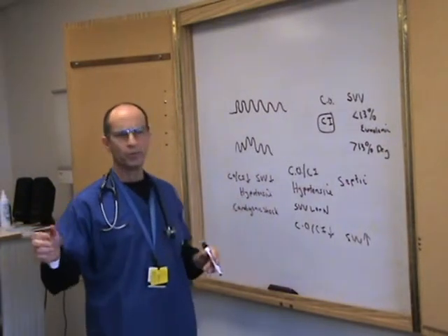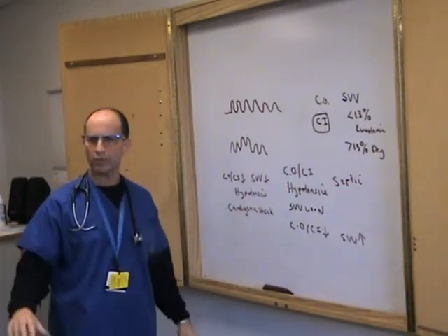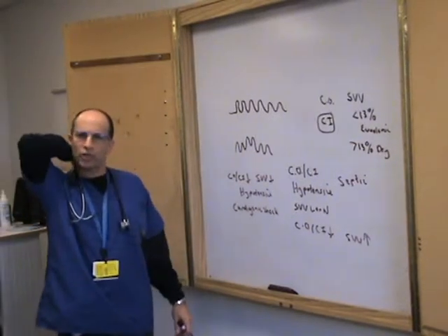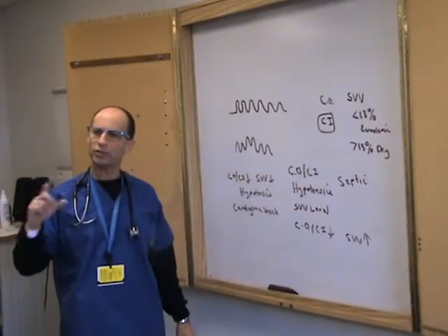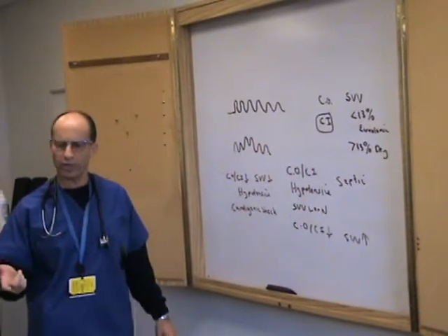Well, the one thing I didn't mention was cardiac outputs and doing the SWAN, or how to do them. We talked about them. Well, cardiac outputs in this one are often done through what's called thermodilution. So you inject cold saline in at a proximal port, you see the temperature change at the distal port. The less the temperature change, the higher the cardiac output. The greater the temperature change, the lower the cardiac output.